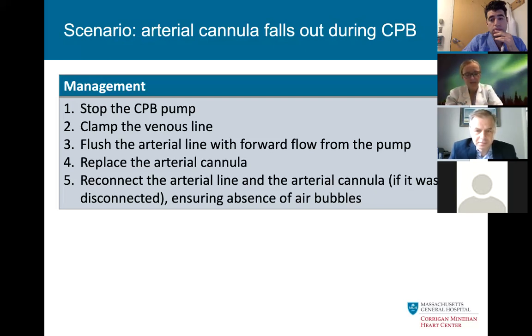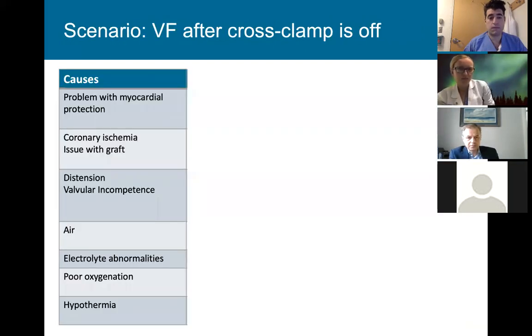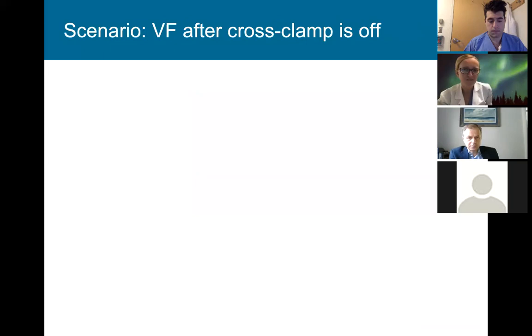Great. I know we're a little bit over time, but I have a few more scenarios left that I was going to just finish up with. VFib after the cross clamp is off. We can do Luis Tapias. What do you think about this one?